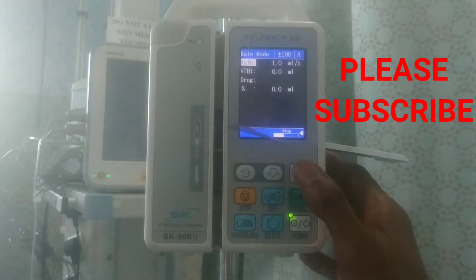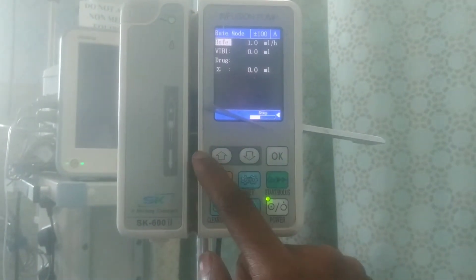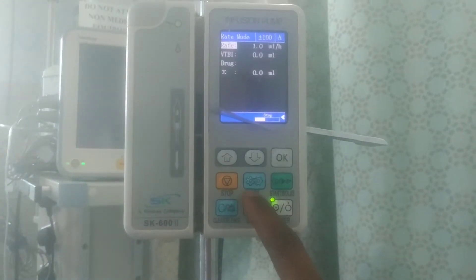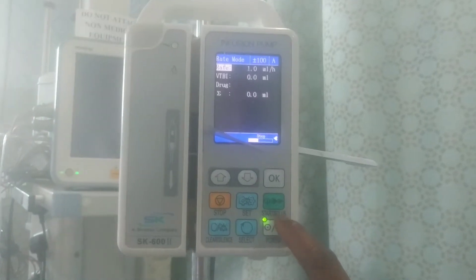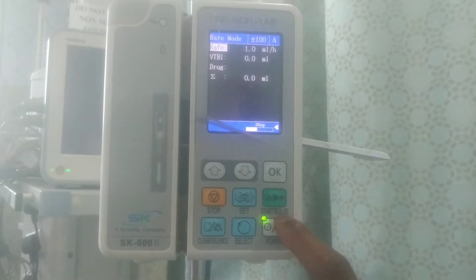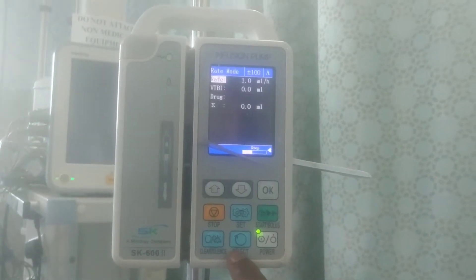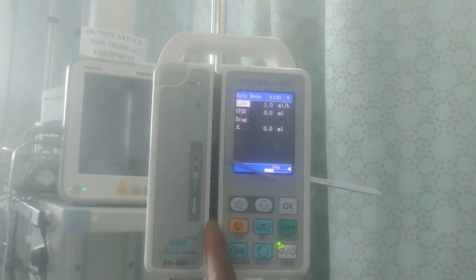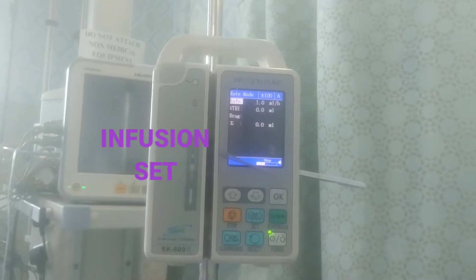Right here we have the OK button. We have the buttons to manipulate up and down. We have this stop button here. We have this set button here. We have this button written start or bolus — this is where you start the infusion. And here we have the clear or silent button. Here we have the select button. And this space here is where you fix your infusion set.